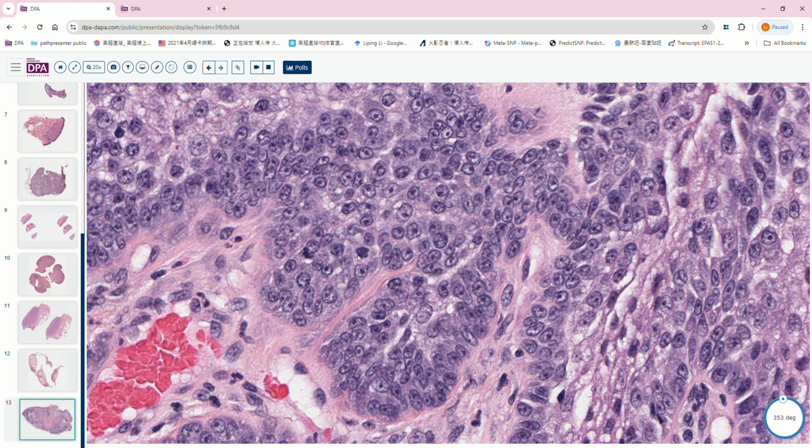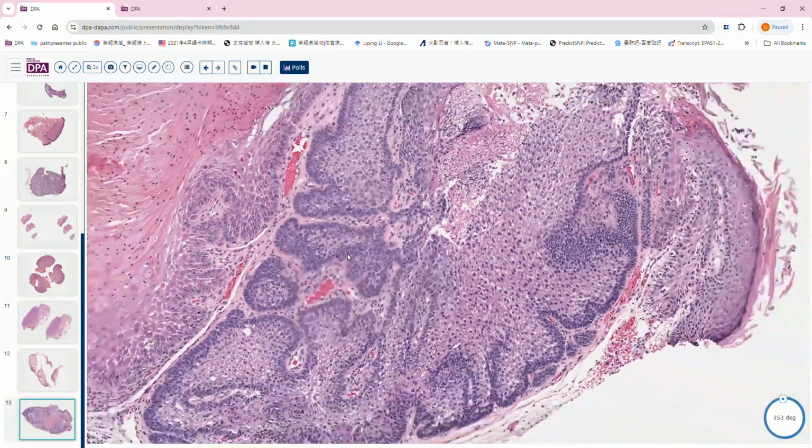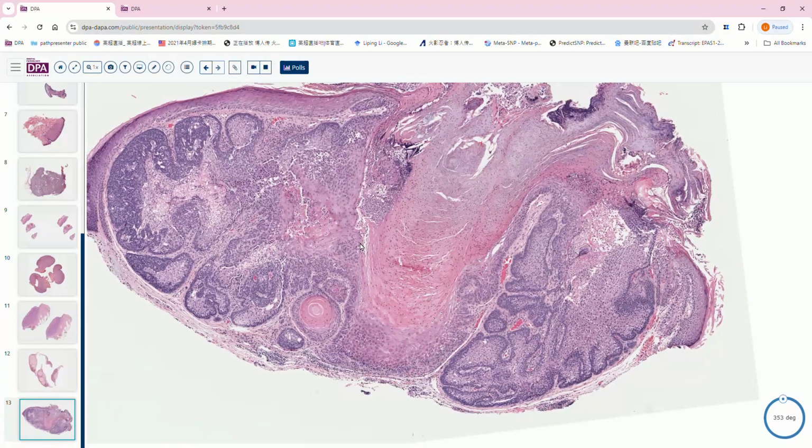You need to bear in mind that in this sebaceous tumor category, you can always find mitosis, but you won't see atypical mitosis. If you want to call this a sebaceous carcinoma, you need to see atypical mitosis, tons of mitosis, and really significant polymorphism.